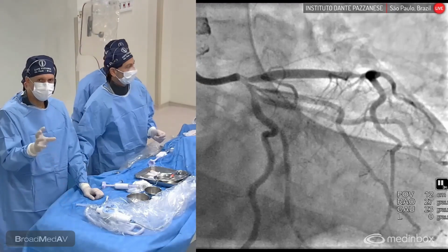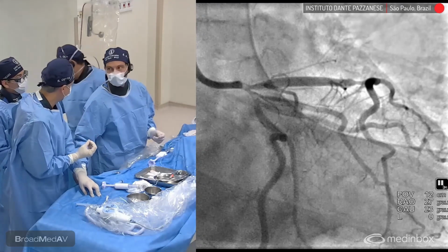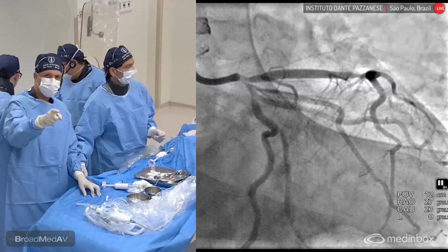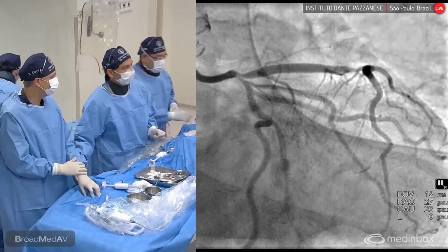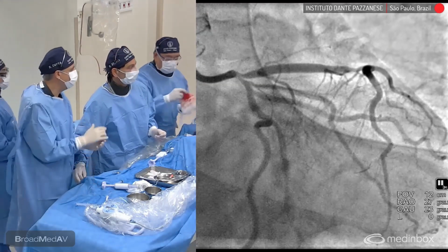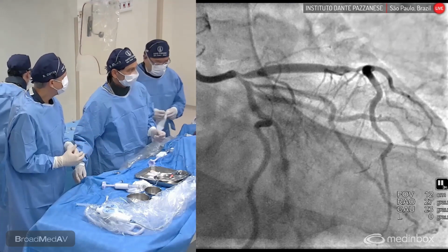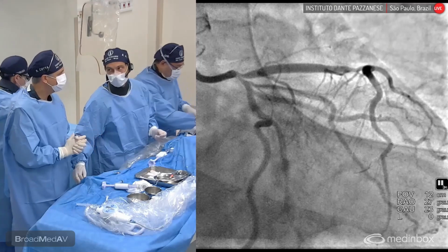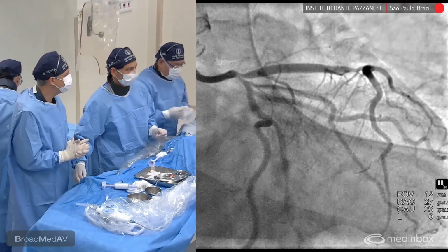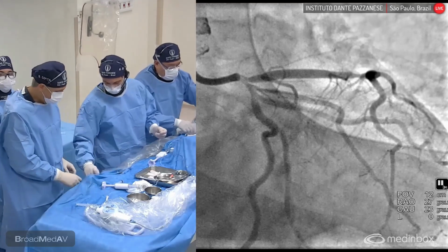This is more evident, a more severe lesion in the left main. Correct. And the ostium of the circumflex also calls the attention. Do you think there's a lesion also in the ostium of the LAD? I think so. Not so severe, though. Next angio here.